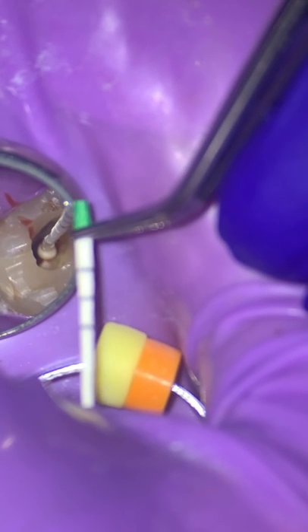So what I'm going to do here is something I've actually started doing once in a while, and it just happened by fluke. I noticed that when I had cases like this and I didn't know what to do, I just placed some BC sealer. Actually, you know how I learned this? Just as I was about to place a gutta percha point a few times, I'd see seepage. I placed my gutta percha point with sealer down and I'm like, oh, why is it bleeding? It's like a slow, slow bleed, and all of a sudden there'd be blood coming up. I'm like, okay, well, that's not good.